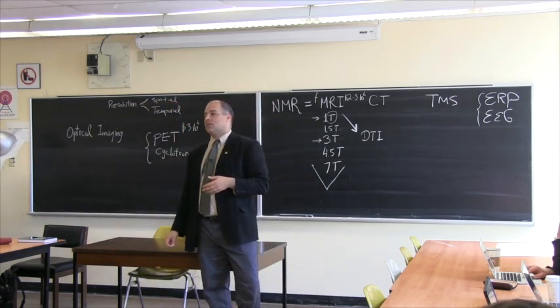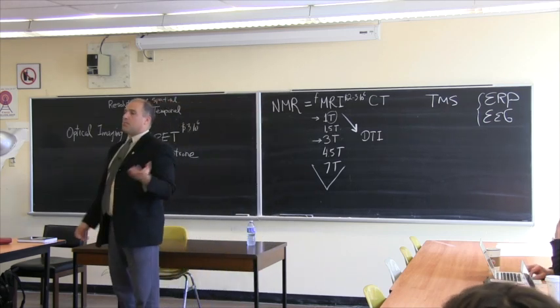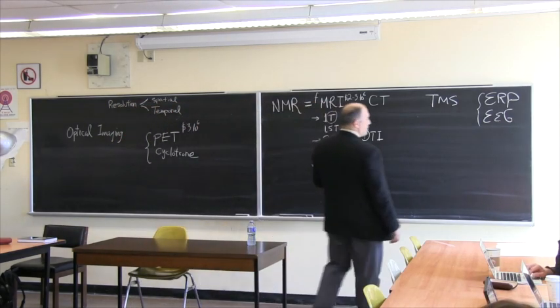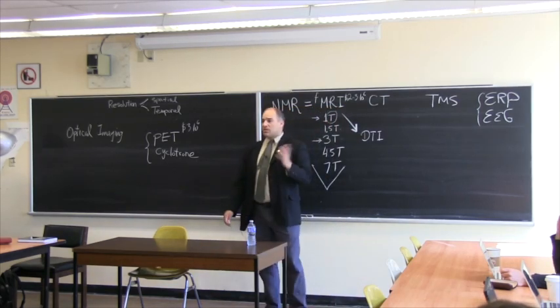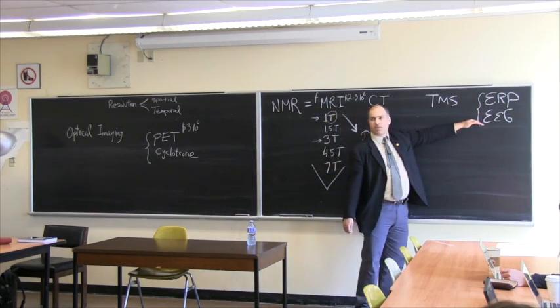So for example, we can see different EEG in people who are sleeping, people who are concentrating, people who are tired, and so on. And sometimes people classify it as alpha waves, beta waves, and delta waves, and things like that. And we have bursts of activity, and we can localize it to a particular area. So there's a very rich literature on EEG. It's been around for a while.